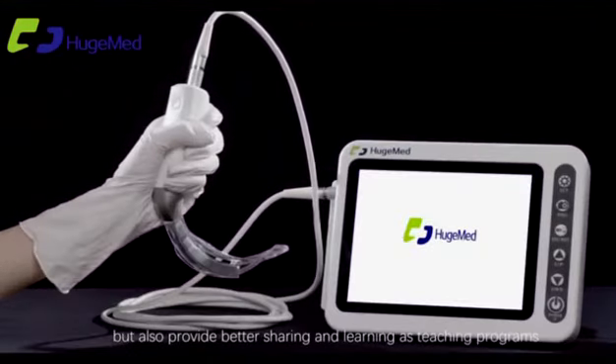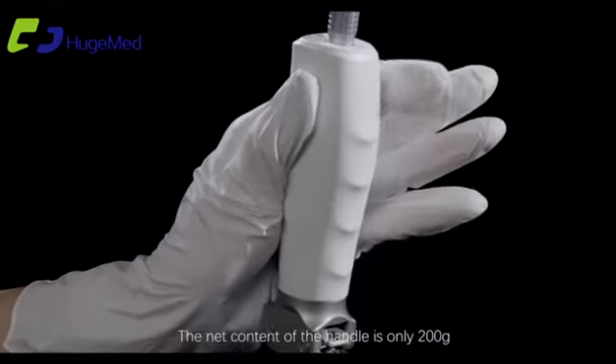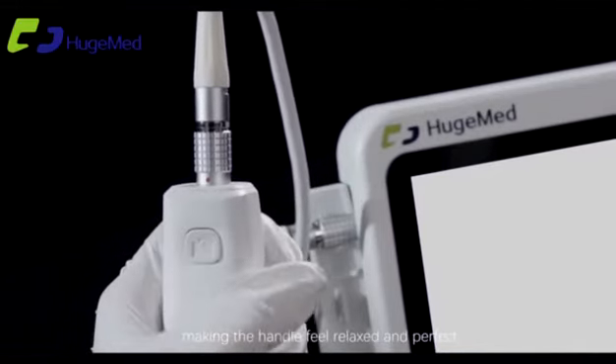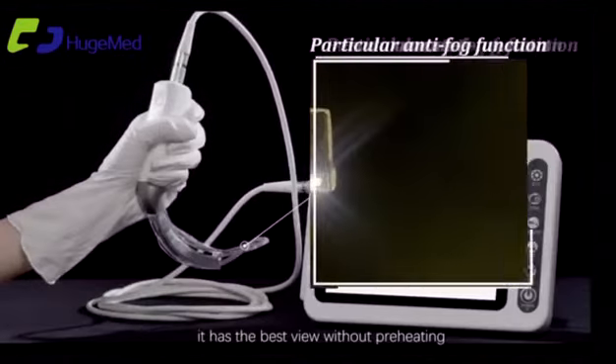The HDMI output also provides better sharing and learning as teaching programs. The net weight of the handle is only 200 grams, which strictly follows ergonomic design requirements, making the handle feel relaxed and comfortable. It features a particular anti-fog function for optimal performance.